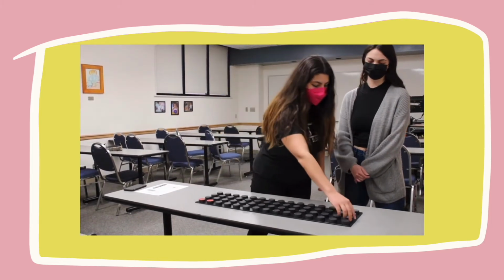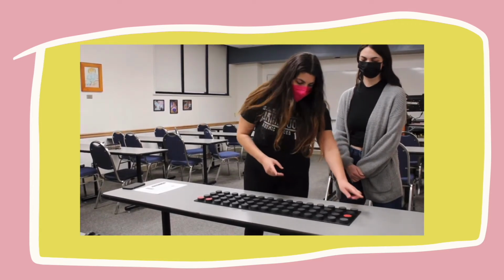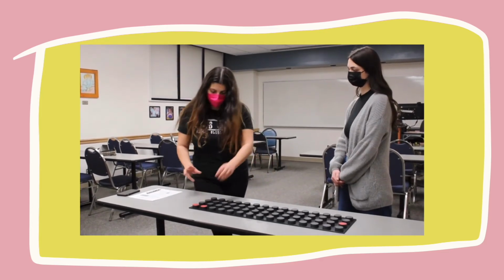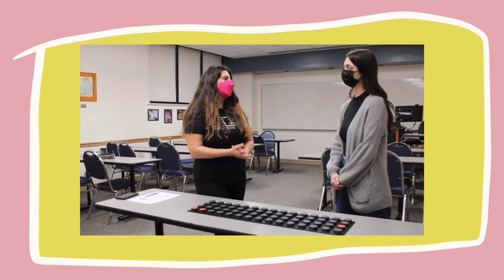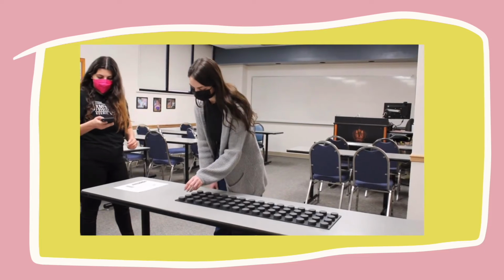Once you get through this whole first row, now you're going to take your right hand and do the same thing: with your right hand, pick it up, transfer it to your left hand, and put it back. And do that for the second row. And then for the third row, you're going to use your left hand again. And then for the fourth row, you're going to use your right hand again. Does that make any sense? Do you have any questions? No, good. Awesome. Are you ready? Ready. All right, go.